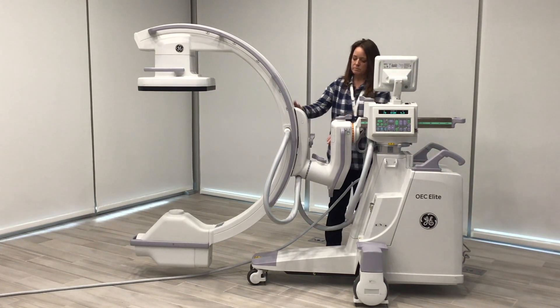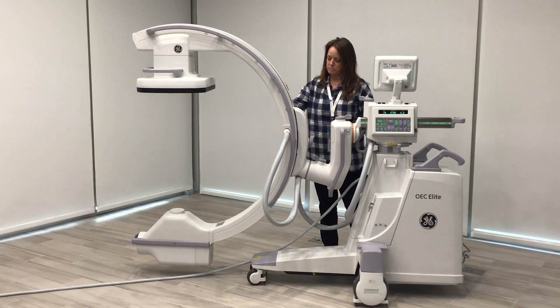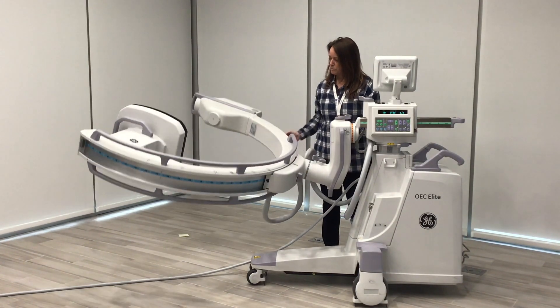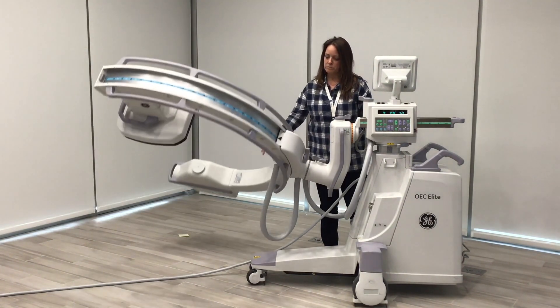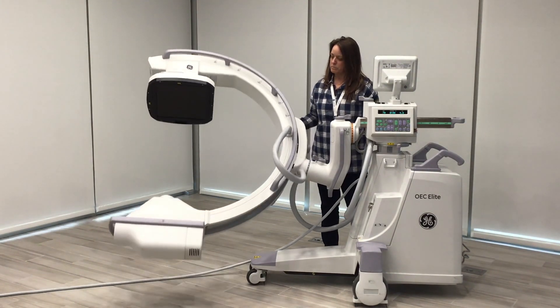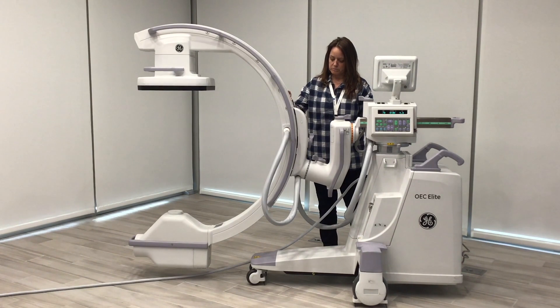From there we move to the gray lock, which in our GE system is called our invert or smart view lock. It also allows you to turn the system completely upside down and pivot it to put your detector on the bottom. We'll go over more about the smart view lock in our positioning talk.